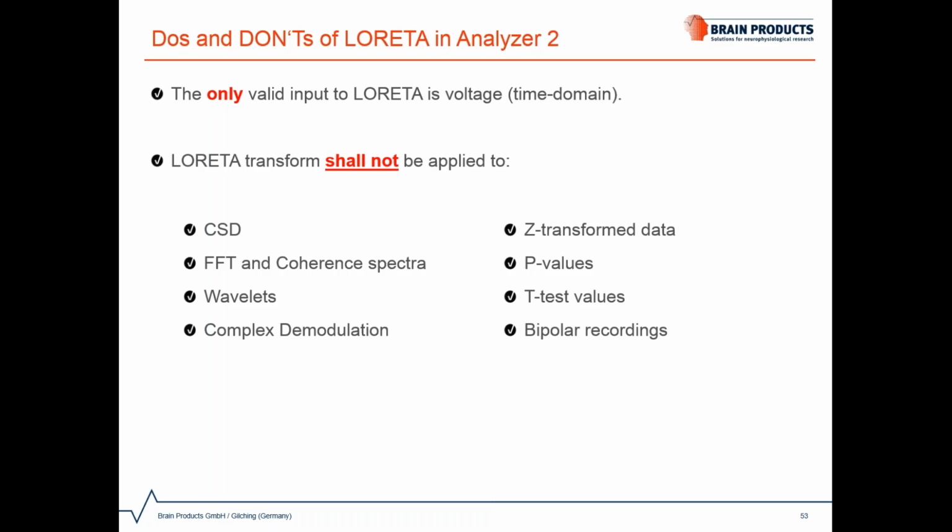So please be aware not to apply LORETA on these transformations, as it violates the mathematical and physics underlying assumptions. Further details on the topic of misusing LORETA can be found in this link.